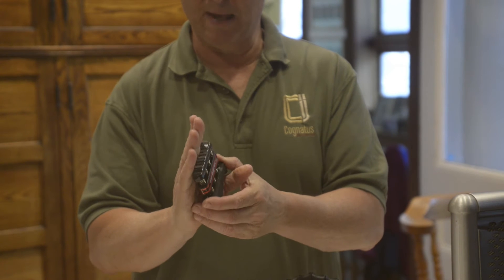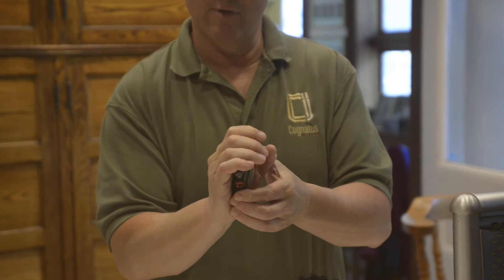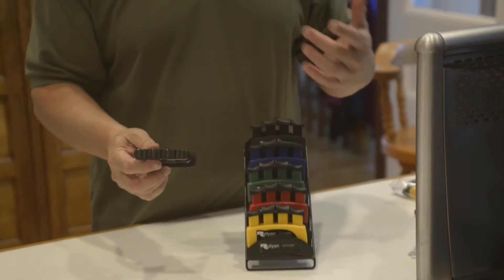The fourth issue is that if you're doing a gross grasp, you're wrapped around these edges, and even for me, they really start cutting into your fingers. So we went and built a much more ergonomic device.